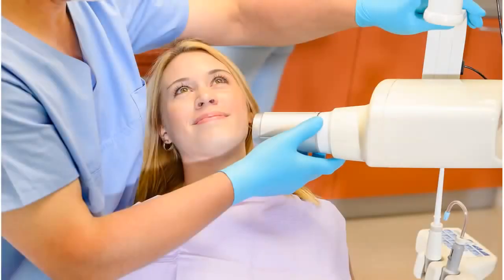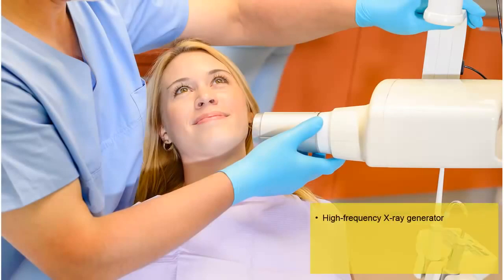The RVG sensor is compatible with all X-ray generators that meet the current standards of intraoral radiology. We recommend a high-frequency X-ray generator so that the patient is exposed to a lower dose of radiation. The X-ray generator must operate with a voltage of 60 to 70 kV. The RVG sensor is not compatible with generators that have a voltage less than 60 kV.